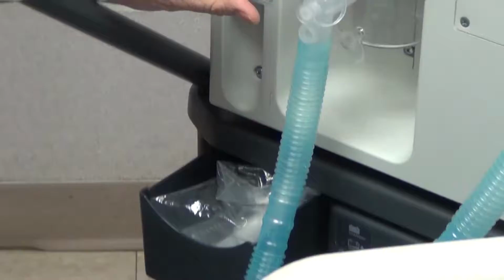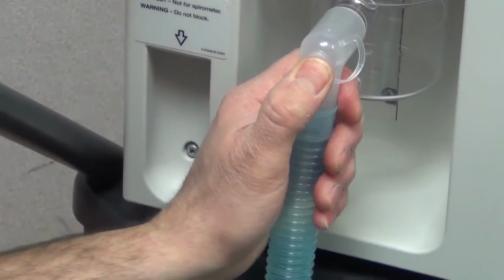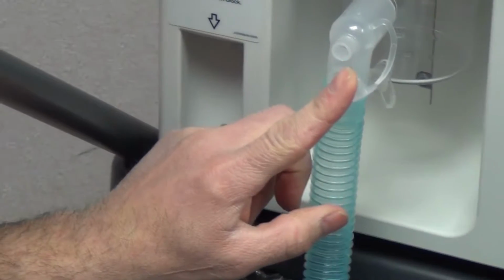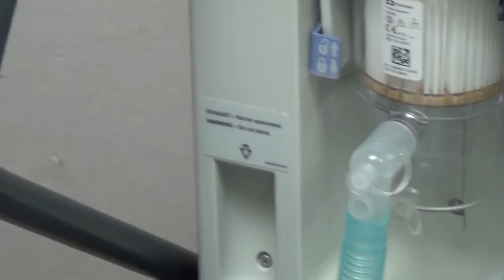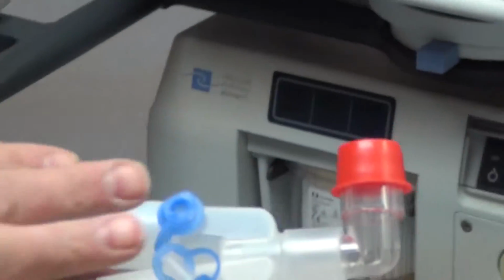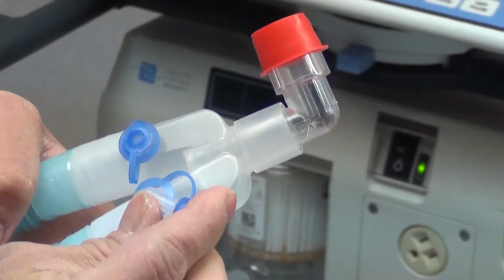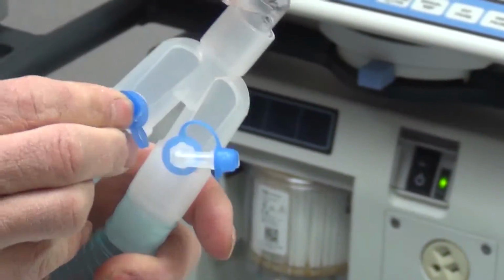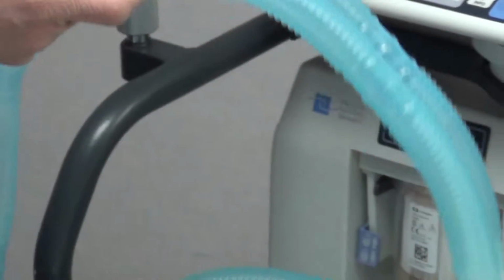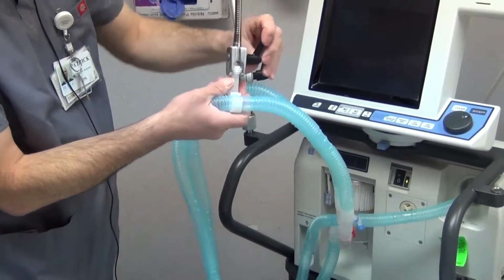If we can zoom in a little closer right here, you'll see that there is a port that is plugged. We have to make sure that that port is plugged. If not, it is a leak, and the ventilator will not ventilate the patient. So make sure that is plugged in. If we come closer to the Y portion of the circuit, you'll see there's also two other ports that could be plugged and unplugged. We have to make sure that these two ports are plugged in. Like that. I'm going to attach this quickly. Have something to hold the circuit.